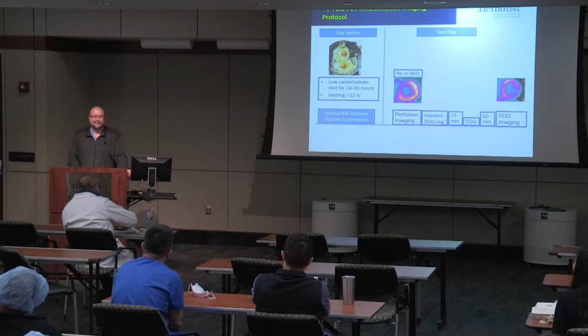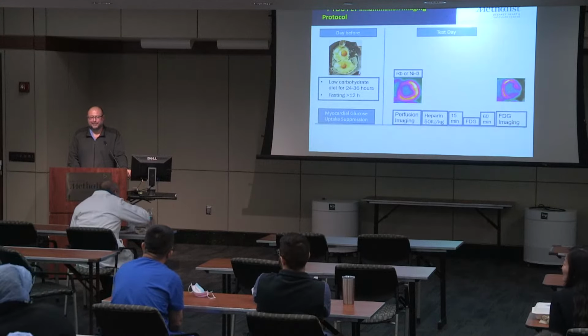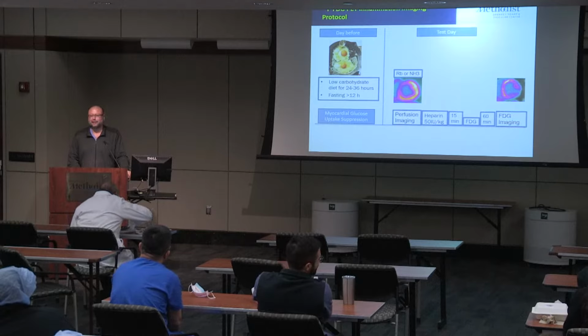The reason I'm going through the technicalities is because sometimes I get a request from the floor at 4 p.m., can we do a sarcoid scan? Like, is the patient prepared? This is not a test you order from the ED and we do it within 30 minutes. This is a test that requires 24 to 48-hour preparation, because we want to make sure that we're picking it up correctly.